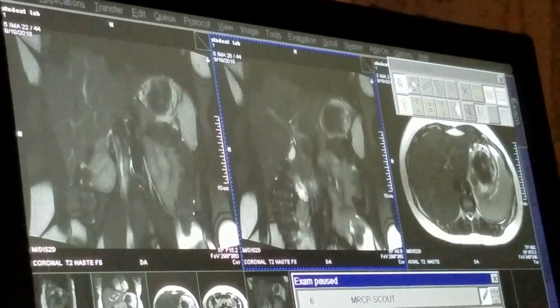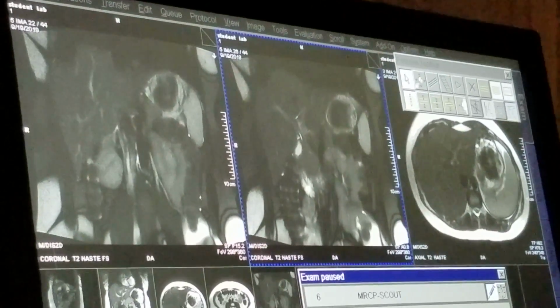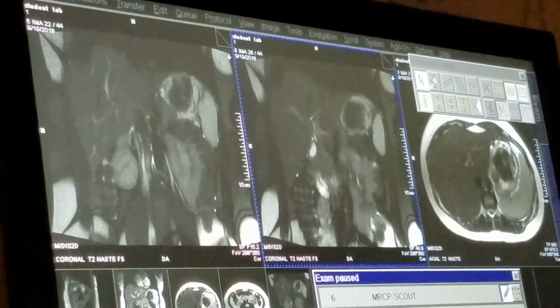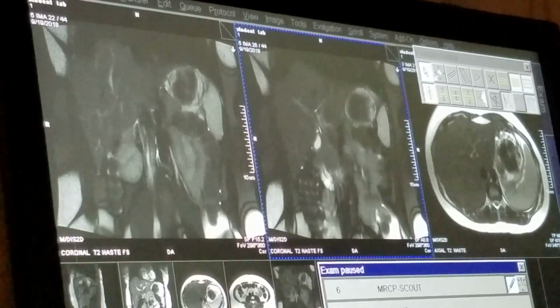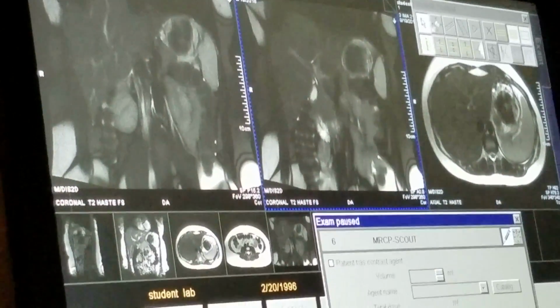Okay, Sarah, please take in a breath. Oh, by the way, Sarah, breathe normally for a moment. By the way, we're back to doing the normal, consistent breath holding, okay? All right. Just thought I'd tell you that. Really good at aiming. What's that? I was really good at aiming. You were very, very good at being inconsistent. Just as good as you've been at being consistent. So back to consistency, okay?